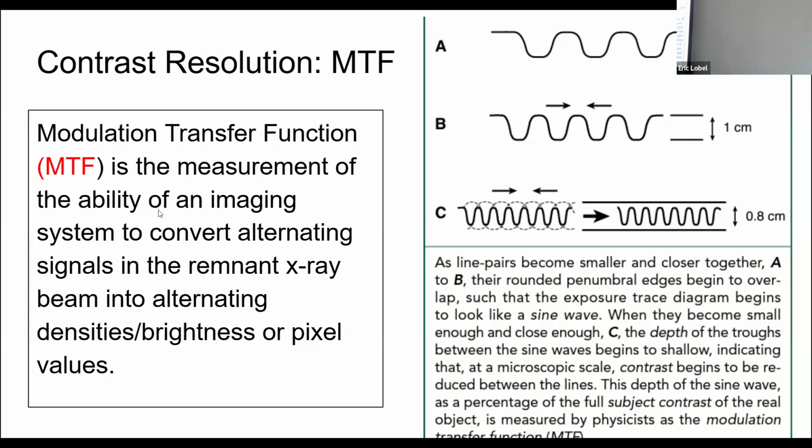And the way it works is the higher on the MTF scale, the higher the number, the closer the image actually represents the object. So, for example, if you got a 0, that would be a black image. That would be 0% object information transferred to image information. A 1 is unrealistic. A 1 would be 100% of the information related to the object transferred to the image. That would be perfect.